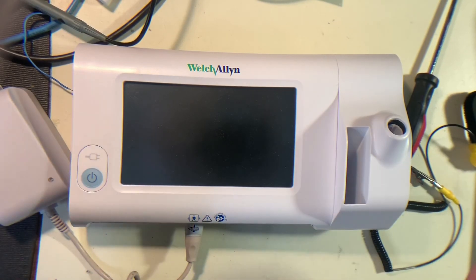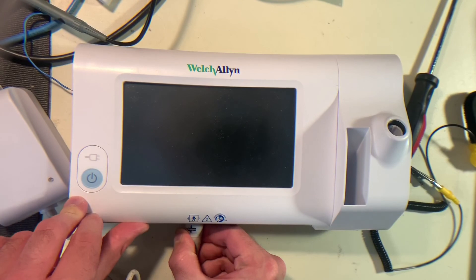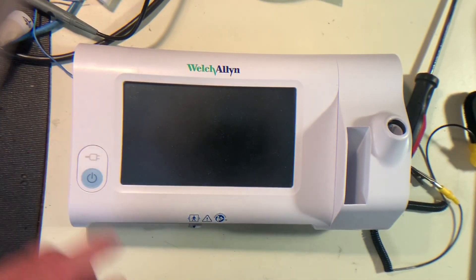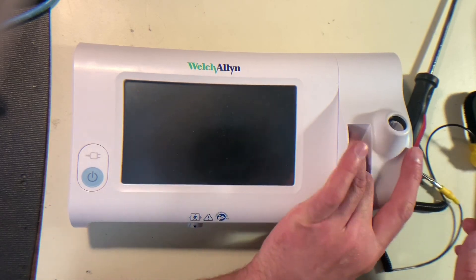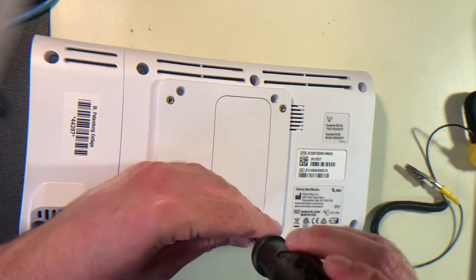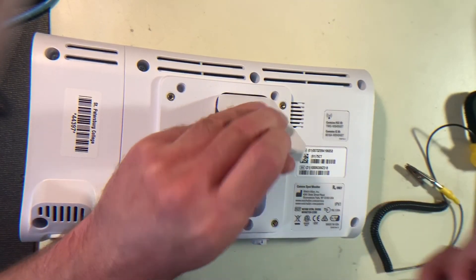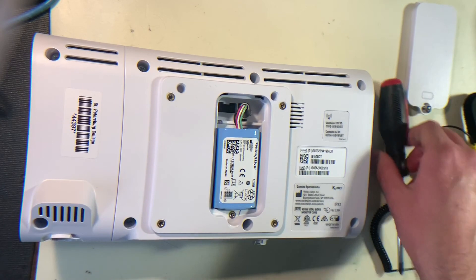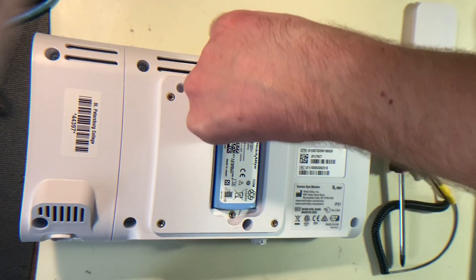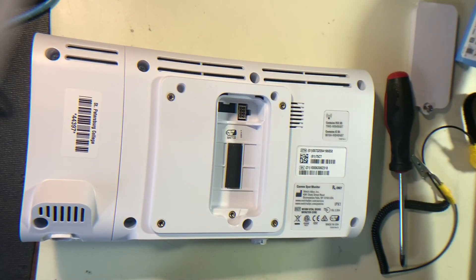First things first, best idea every time you're taking something apart: remove the power supply and just set that aside. Next we want to flip it over and remove the battery just underneath this door here. You want to squeeze this connector down here and then pull it out because there is a little clip on it. Pull it out like that and just set that aside for now.